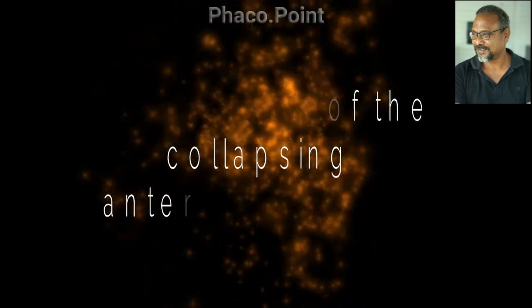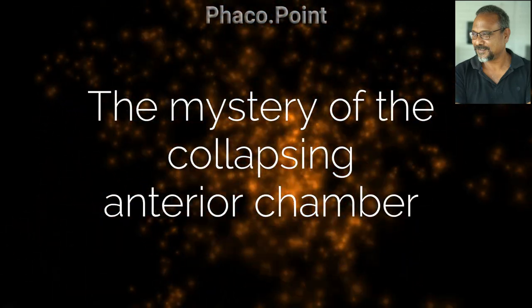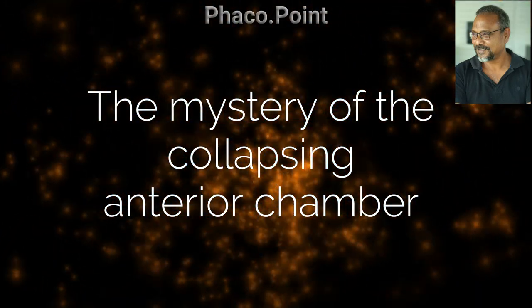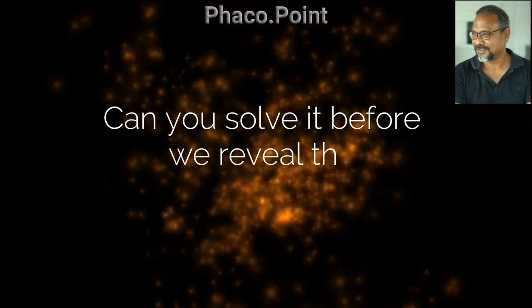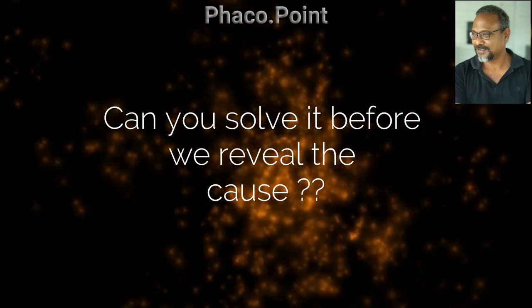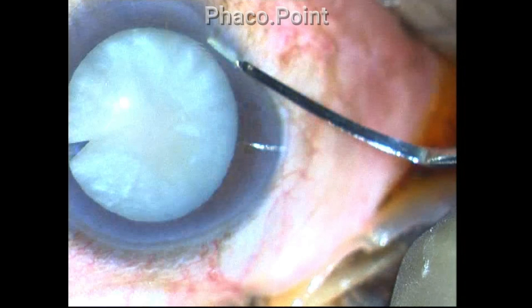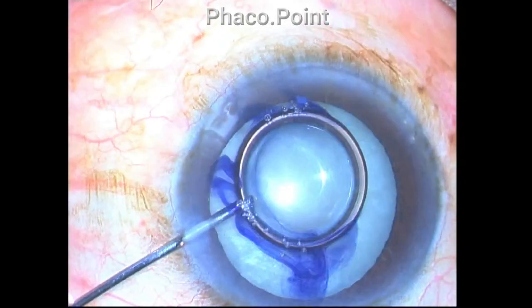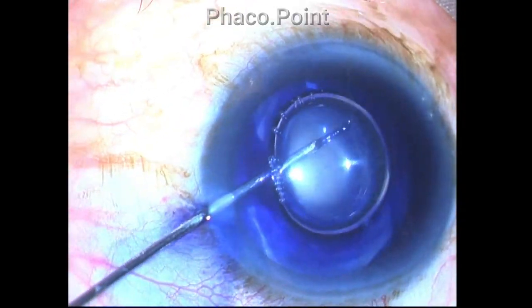My dear friends and colleagues, today I'd like to present a very interesting case where the anterior chamber kept collapsing while I was performing phacoemulsification. And I wonder if you can solve the mystery before we actually reveal the cause. This was a mature cataract with a chalky nucleus sclerosis.